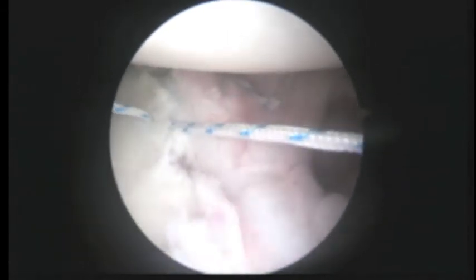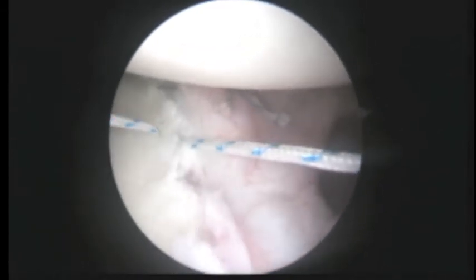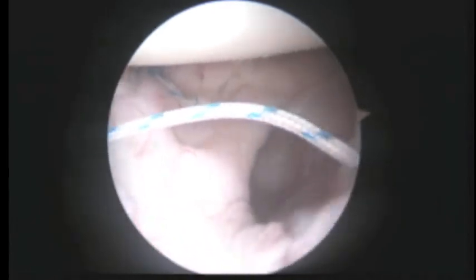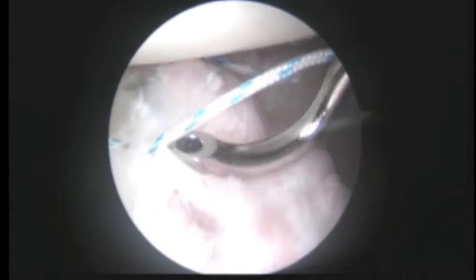Okay, we've placed a second anchor along the front, as you can see here. Pull that back a little bit. Okay. And next we're going to take our suture hook and make another pass through the capsule. So we're going to go through right about here.